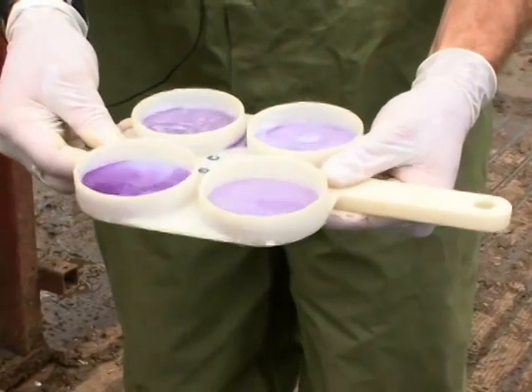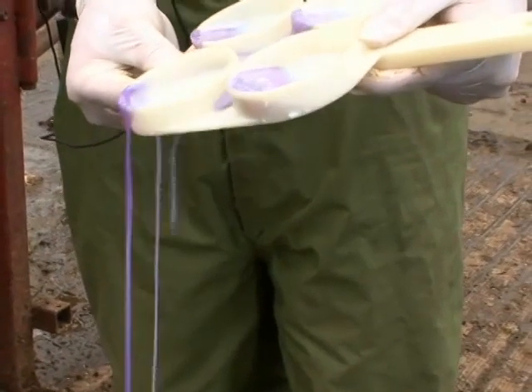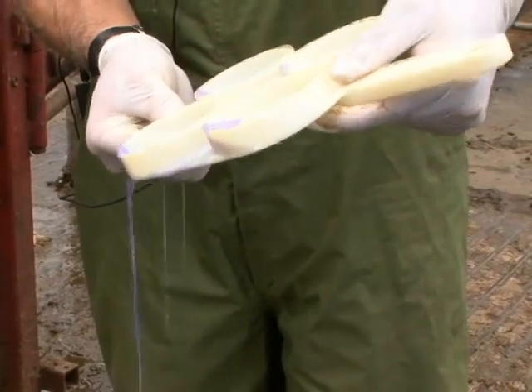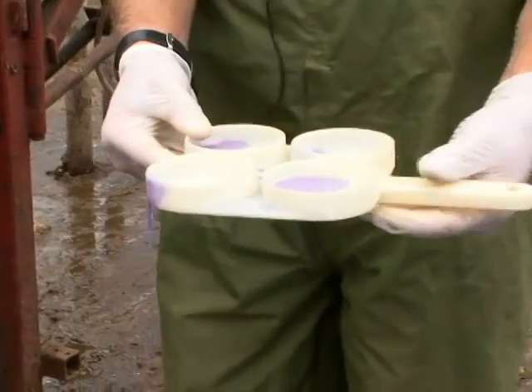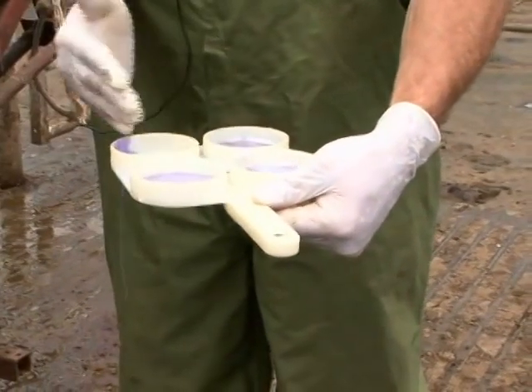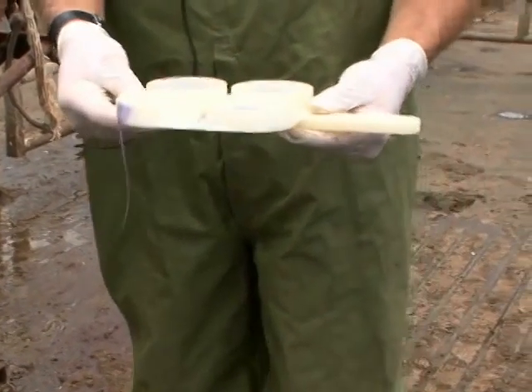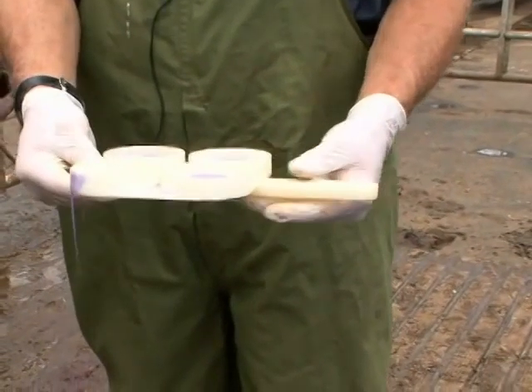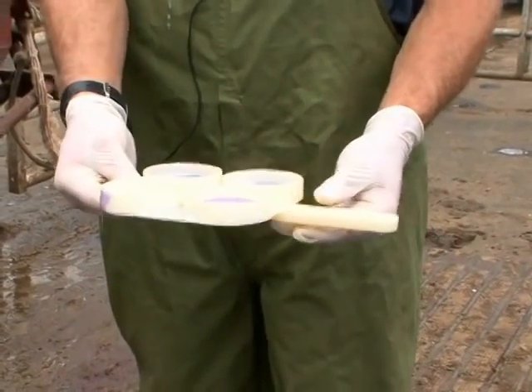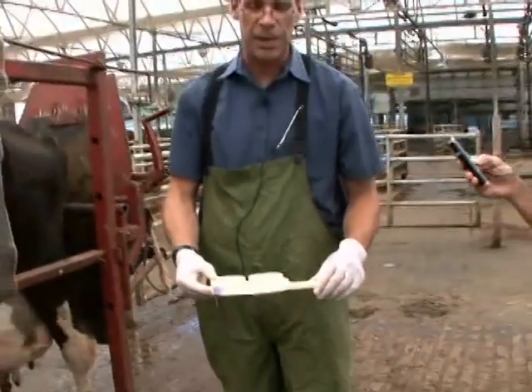So to make it even more dramatic is if I tilt it over and allow it to pour out, you'll see it sticks together and comes out in one big giant clump, which indicates a serious infection in that quarter. So in this particular cow, her right hind quarter has subclinical mastitis, and possibly if we strip longer, we may actually find that she has clinical mastitis. This is a great cow side test to determine which quarters are high in somatic cell counts and maybe need treatment.